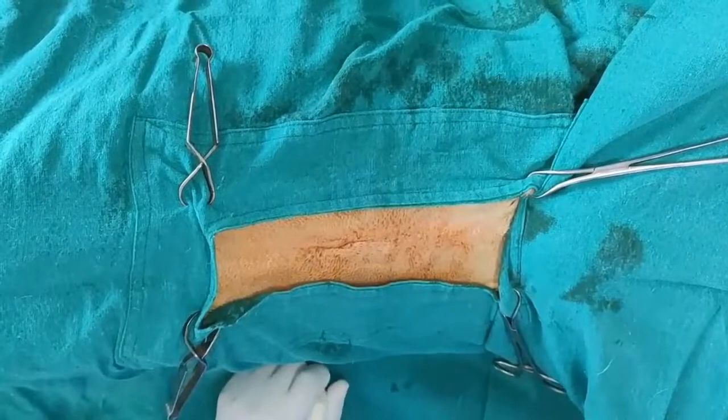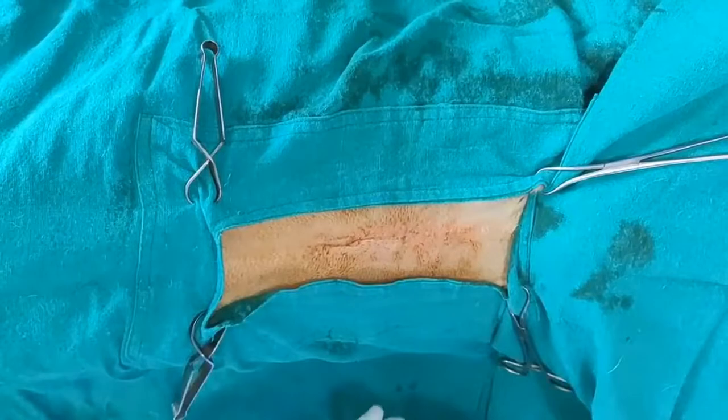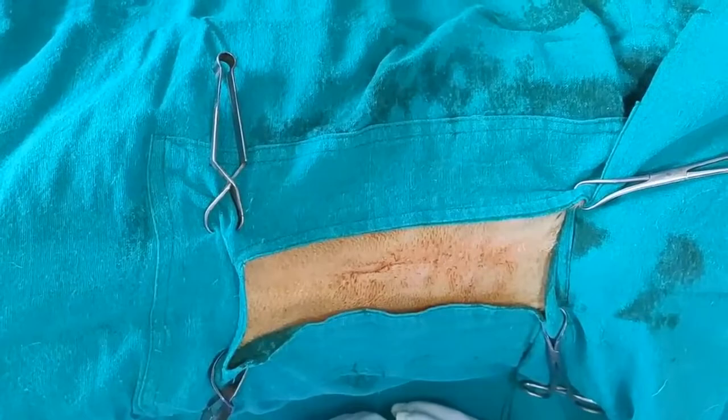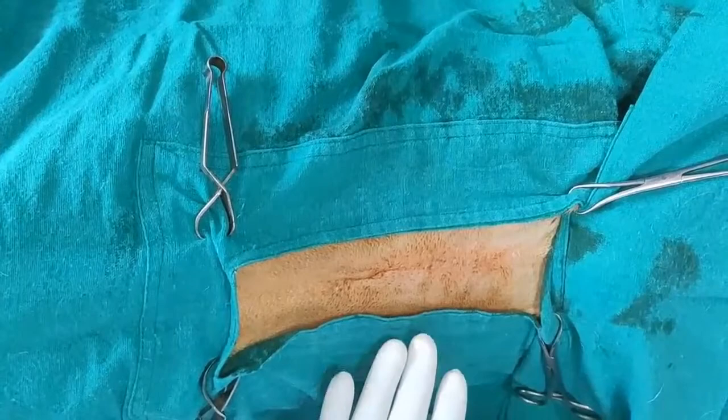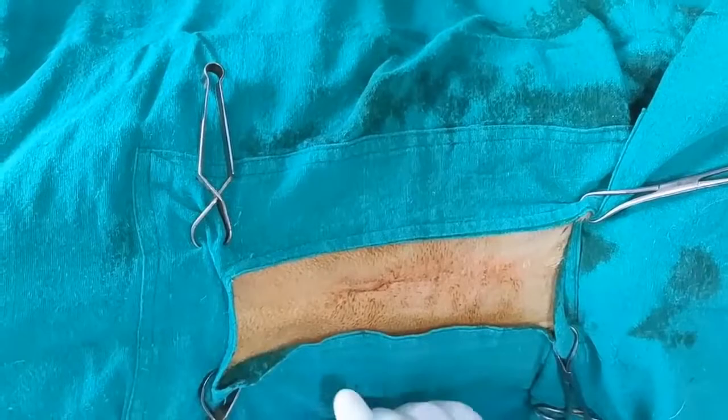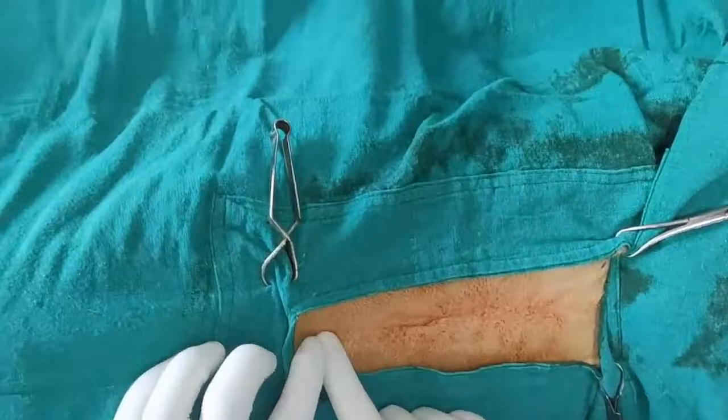Then we suspected that there could be some foreign body in the stomach, so for that we also performed a barium series, but I don't think there will be any foreign body in the stomach. Still, it is a rule that whenever you go for a laparotomy with the intention to exteriorize the intestine and locate the foreign body, we should also examine the stomach. So I will give the incision post-xiphoid. I start a little bit from here to here.